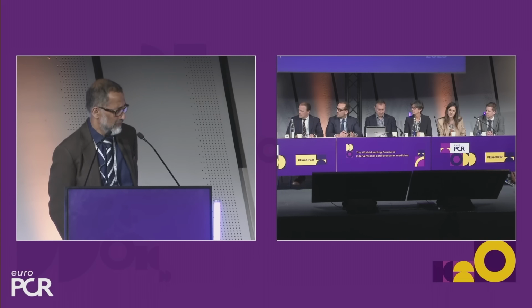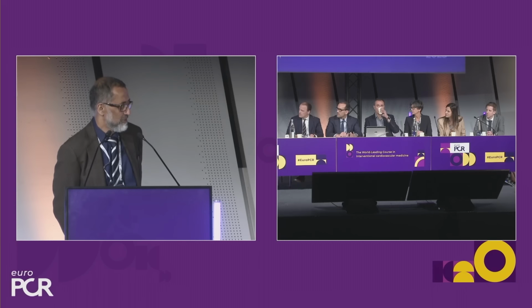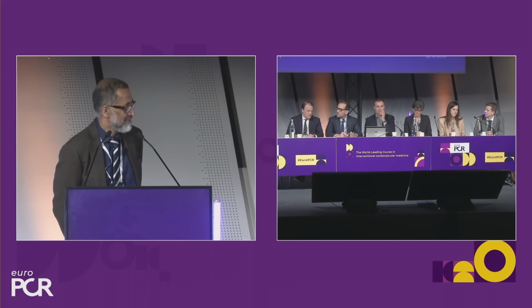And then the next week, we've usually discussed it at the MDT, where the radiologist is there and a cardiac surgeon is there. So we've got the full MDT, and we've made a final decision about what we want to do. So no advanced coronary angiography. If the MDT feels we're not sure, we probably won't repeat the CT scan because they may still be blurry. But our CT quality is excellent. The only time is when there's a breath moving, and then the annulus is blurry as well, and we have to repeat it.